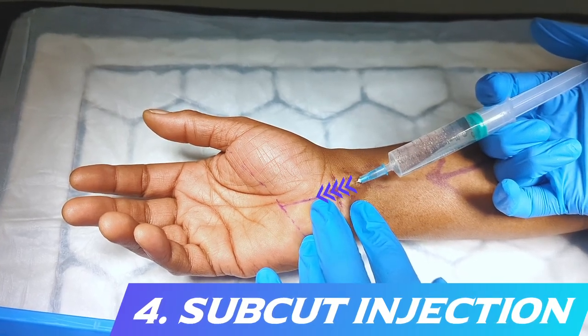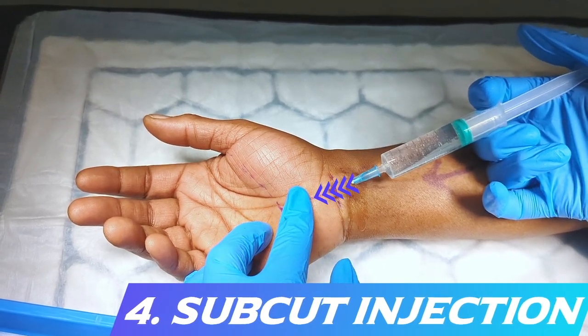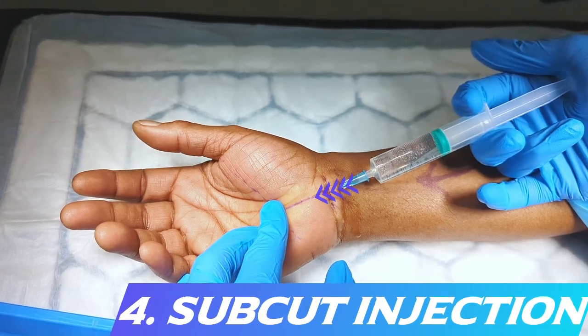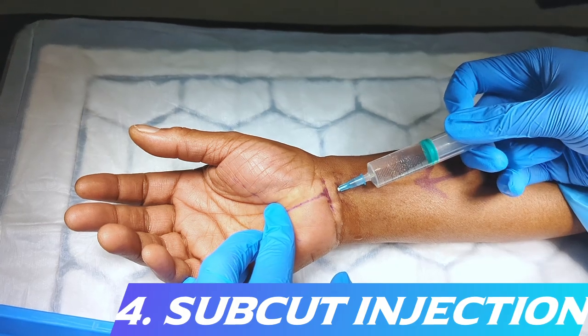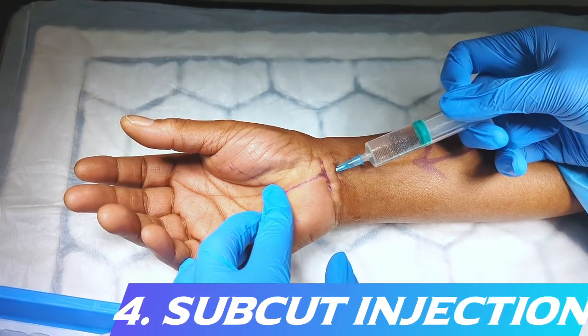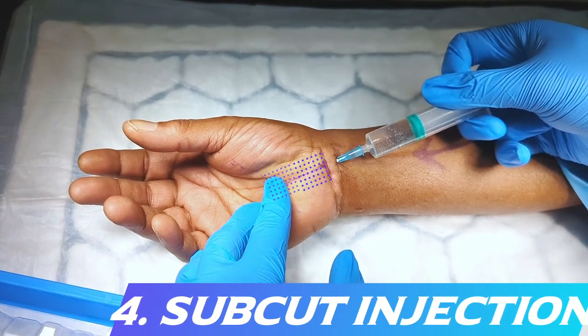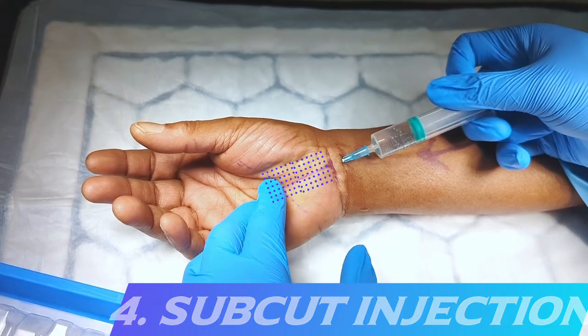The surgeon's finger palpates the tissue distally to feel for firmness as the local anaesthetic fills the tissue. The surgeon continues to infiltrate the anaesthetic until their finger can feel the firmness of the infiltrated tissue at the distal extent of the incision. The entire area around the incision should feel firm and look blanched when infiltration is complete.